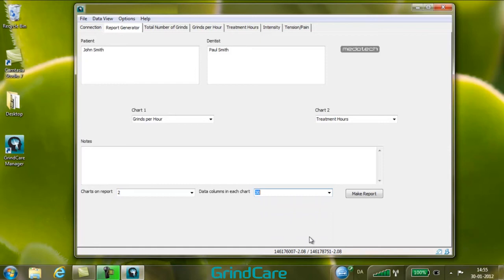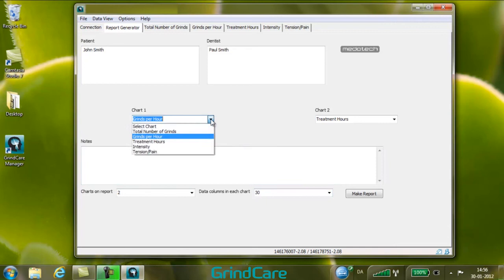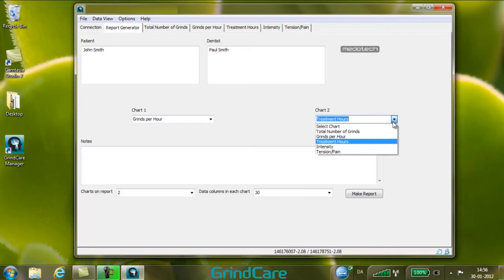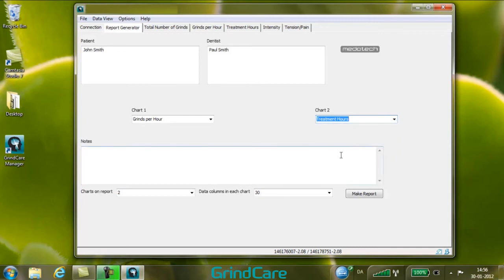The selected number is saved in GrindCare Manager and will be the default for future reports, but can be changed for each patient. Select which data is to be displayed in each bar chart — the selection is also saved as the default for future reports, and can be changed per patient if needed. Based on the recorded data, a diagnosis and treatment plan or other patient-related notes can be entered, and this information is saved with the patient file for all subsequent reports.